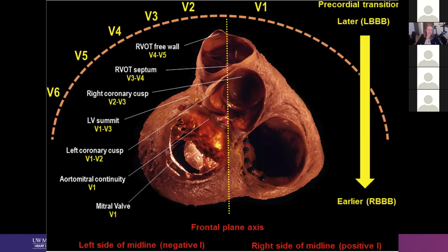So really taking a peek at that, scrutinizing that, especially if you have patterns that don't make sense. You can get big changes, and all of those criteria will be irrelevant if your precordial leads are moved around. This is also really important in obese patients and in female patients, where folks sometimes get squeamish about the female breast and don't put the EKG leads in the correct place. So making sure that we're really lining them up with our usual landmarks.